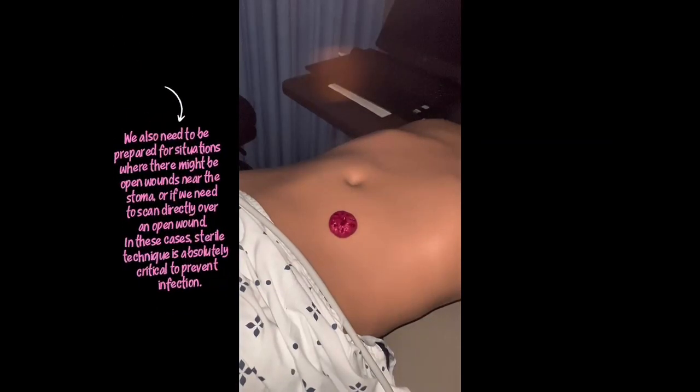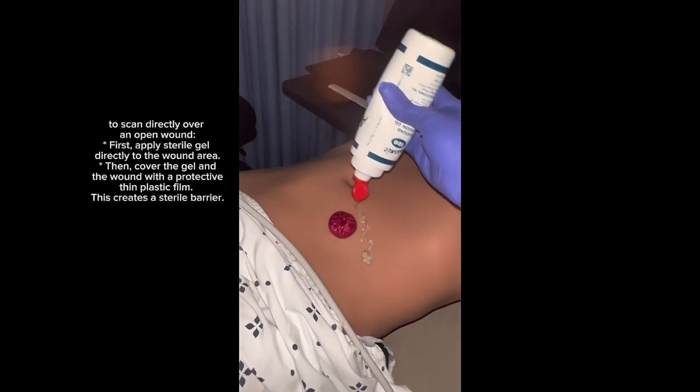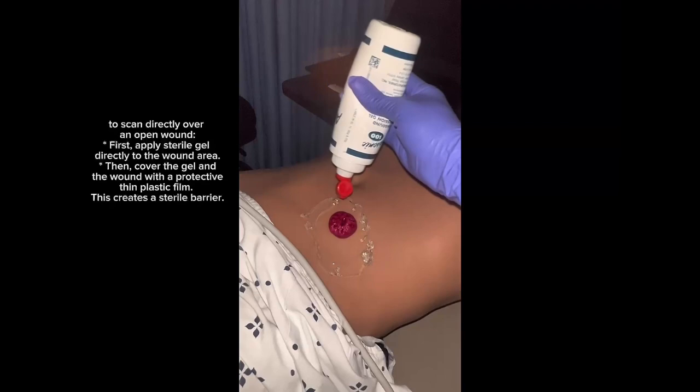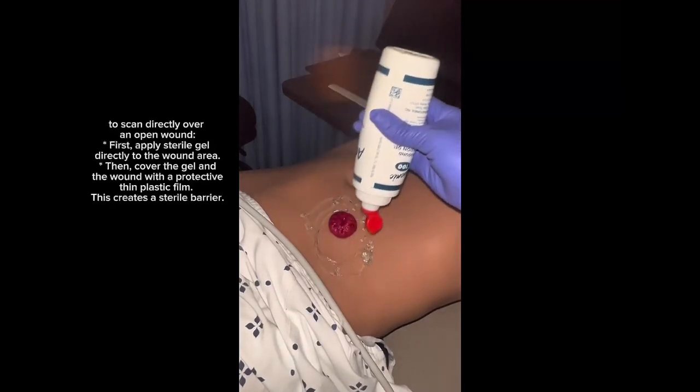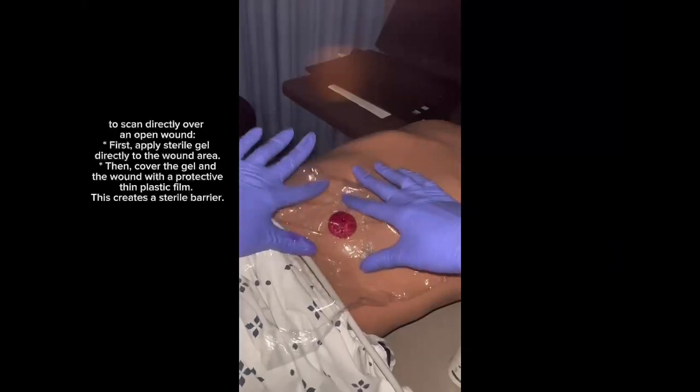We also need to be prepared for situations where there might be open wounds near the stoma, or if we need to scan directly over an open wound. In this case, sterile technique is absolutely critical to prevent infection. To scan directly over an open wound, first, apply sterile gel directly to the wound area, then cover the gel and the wound with a protective thin plastic film.